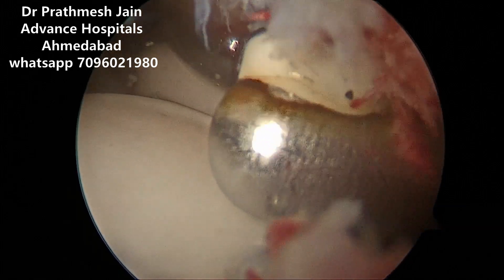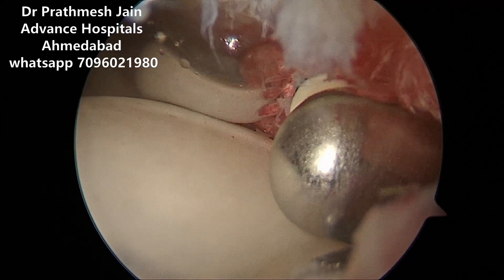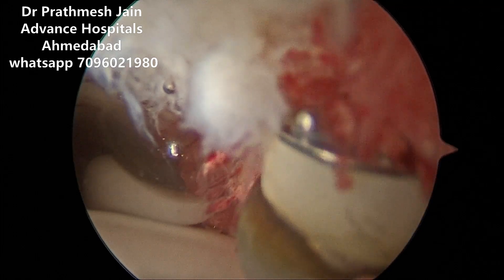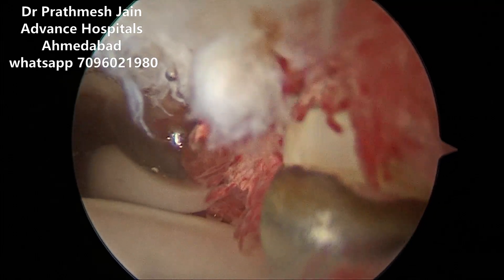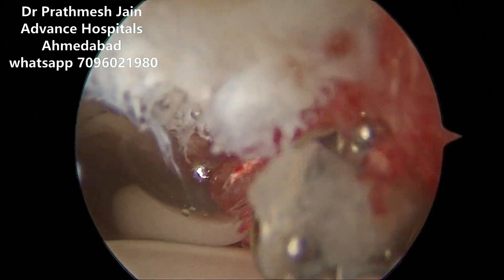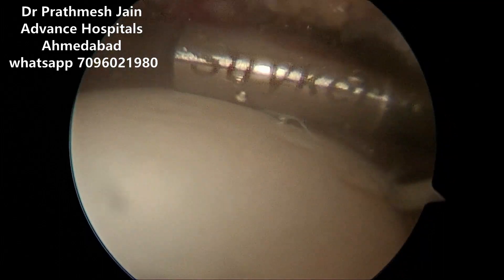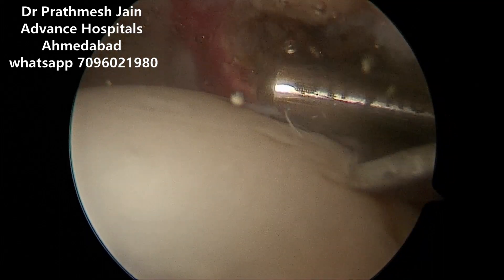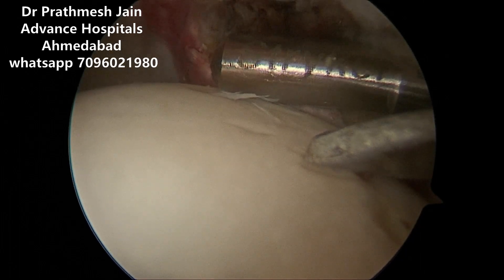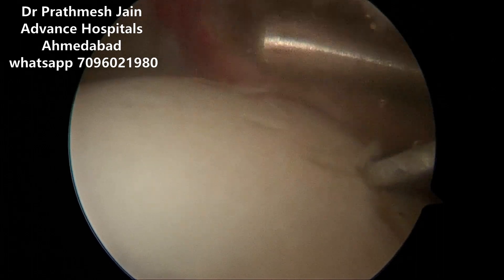You can see a significant inflammatory reaction in the capsule, and you can see a little bit of fraying in the labrum as well, which is the result of a little bit of femoroacetabular impingement that this patient has. Once we are through with the radio frequency device, we can use the shaver as well to increase the capsulotomy on the anterolateral and anteromedial aspect.